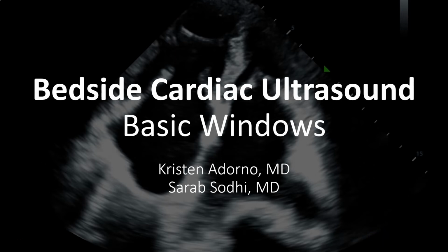Today we're going to talk briefly about the basics of cardiac ultrasound and the basic windows and how to get them. This lecture was initially put together by my just recently departed fellow, Dr. Adorno, but there were some minor changes that needed to be made, so I will re-narrate it.